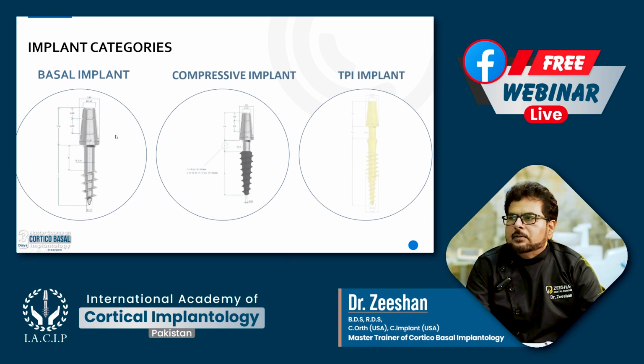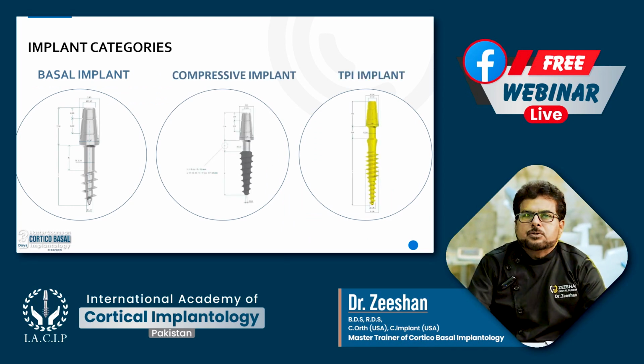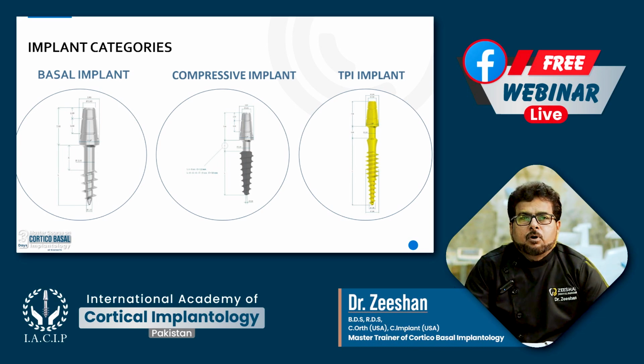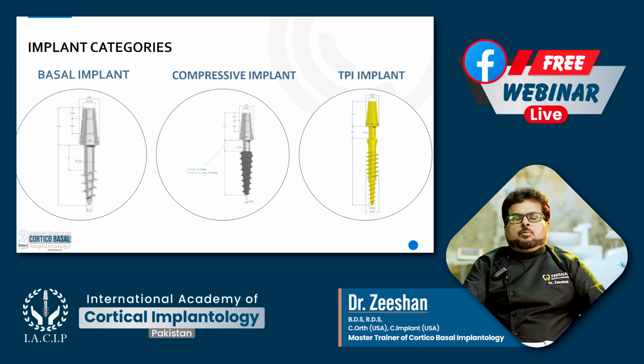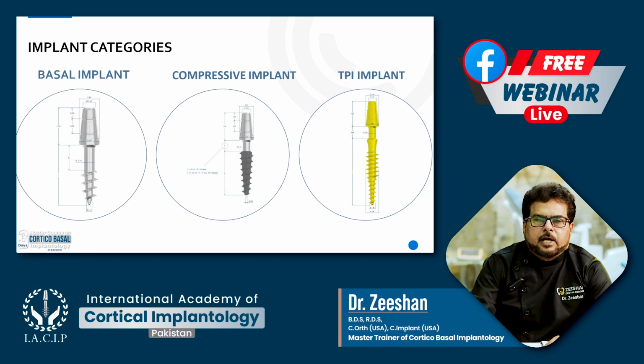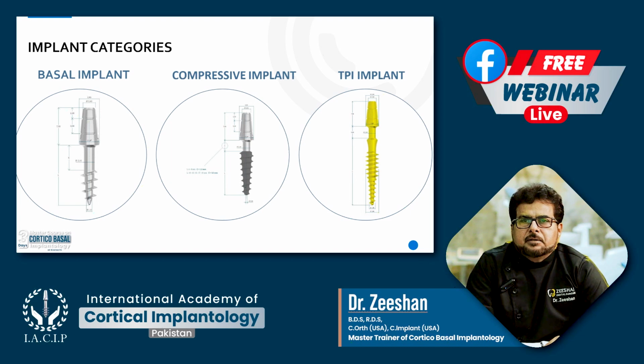Now we are using three types of basal implant here. We want to discuss the basal implant, which is a highly polished, fully polished surface implant. Then we have the compressive implant, which has a surface treated portion, and then we have another implant which is TPI implant. So these provide us more and more stability, primary stability.